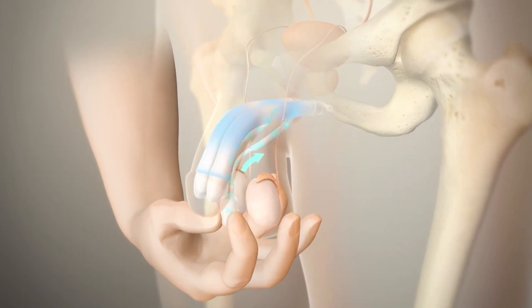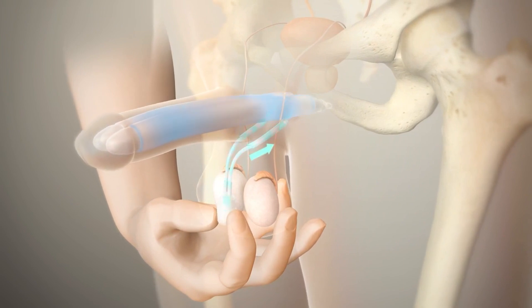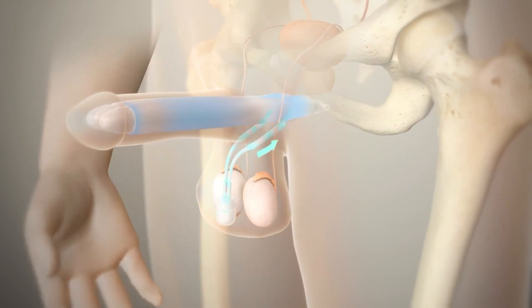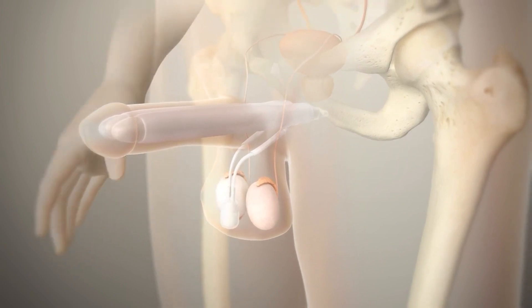Fluid is transferred from the reservoir into the cylinders through the pump. When you're interested in an erection, it goes up every time you want it to, and it stays up for as long as you want.